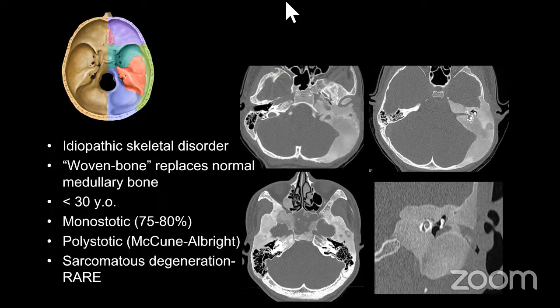So if you see something like this, just get a CT sometimes. And what you'll see is that this patient has diffuse fibrous dysplasia involving the skull base. And all of this stuff on MR can really fool you. And now all this is really extensive fibrous dysplasia.